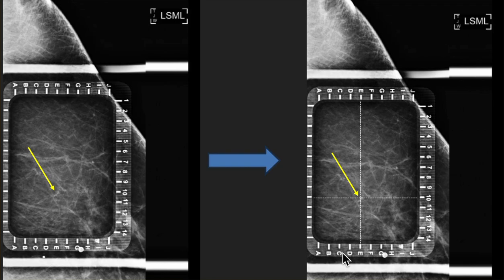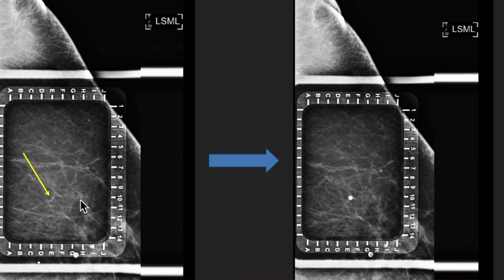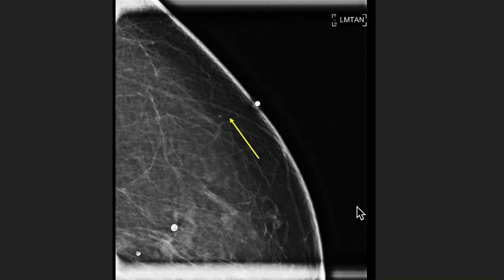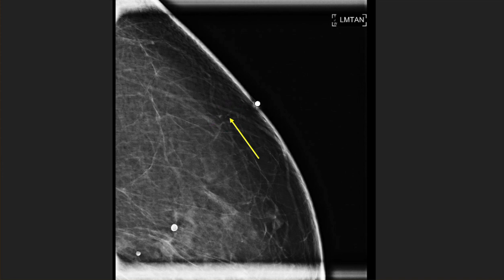You work out the coordinates — in this case they're at E10. Using the cursor on the tomosynthesis unit, we put our BB on E10 and take an image to confirm that yes, the calcs and the BB are now overlying. The patient is then turned such that the BB and the skin surface under it are perpendicular to the paddle — that is super important. The tech can move the breast to get the best tangential view. In this patient, here's our BB right on the edge of the skin. Unfortunately, the calcifications are below the level of the skin, so these are not skin calcifications. They went on to stereotactic biopsy and were shown to be dystrophic.